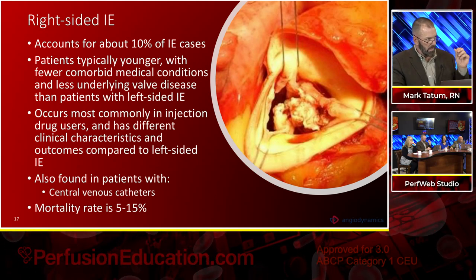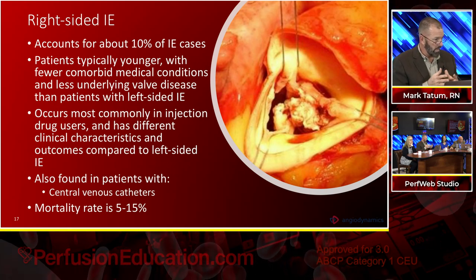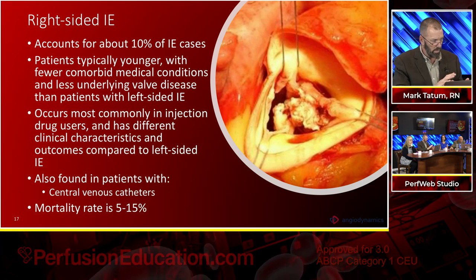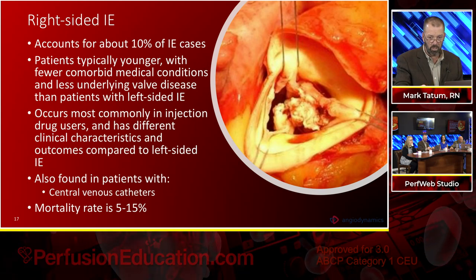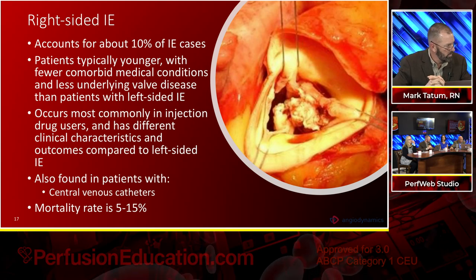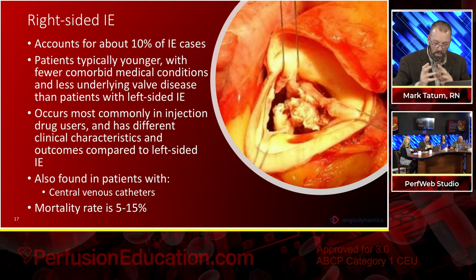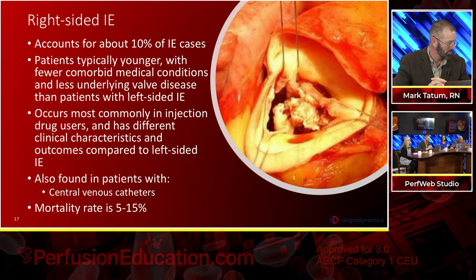The incidence, as an example: the AngioVac cannula was used in a short series of patients done at a university in the U.S. And the physician who did this study of 40-some-odd patients was able to treat successfully using AngioVac as the treatment modality to remove or debulk the vegetation. But in 45% of the patients, the tricuspid regurgitation was worse after the AngioVac case than it was before. A big question that we had around this, because one of the most common questions we get is, are we going to damage the valve? And it's a great question.